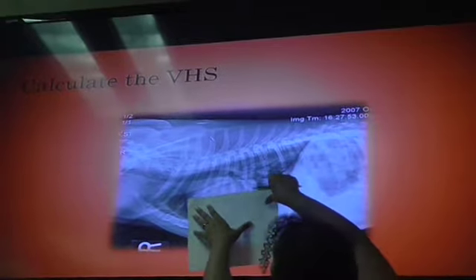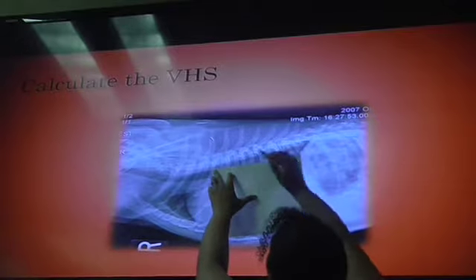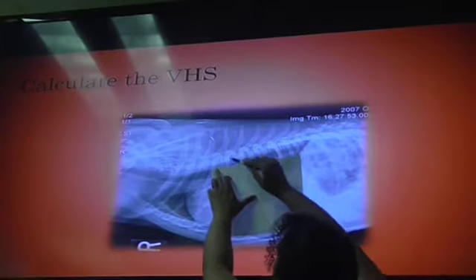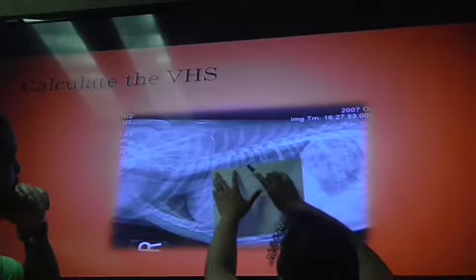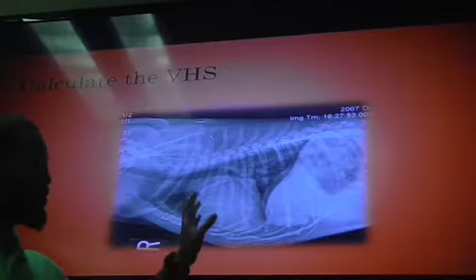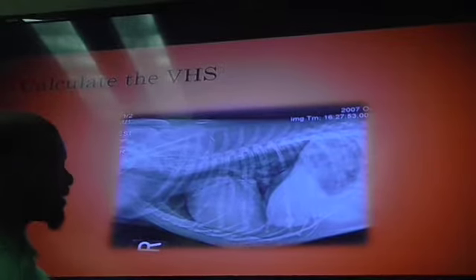Right? So then you find the fourth rib, 1, 2, 3, 4. Line it up, and then you count from my mark. 1, 2, 3. You count the space of the ribs. 1, 2, 3, 4, like 5, and then another 1, 2, 3, 4, again another 5. So it's going to be around 10. Yeah, so we said around 5 or 6, depending on what you count. Make sure you don't count the ribs on the other side. Oh, yeah. Y'all got 5. Yeah, because it all depends on what you count.